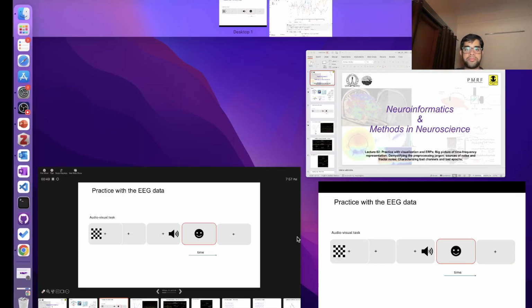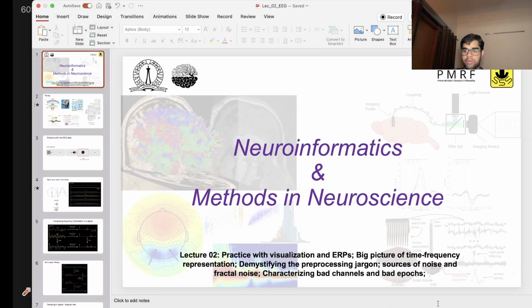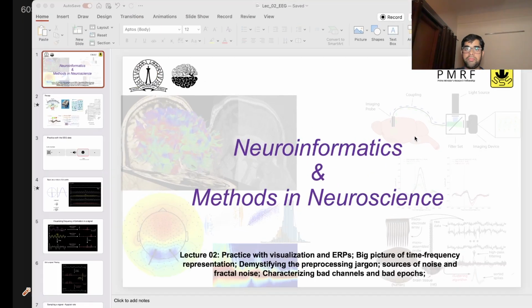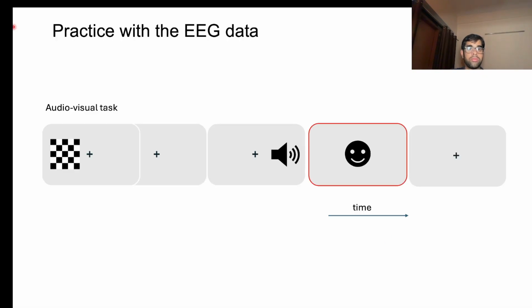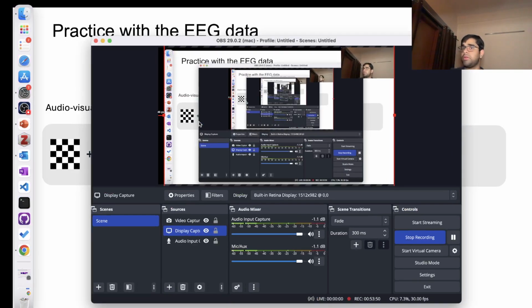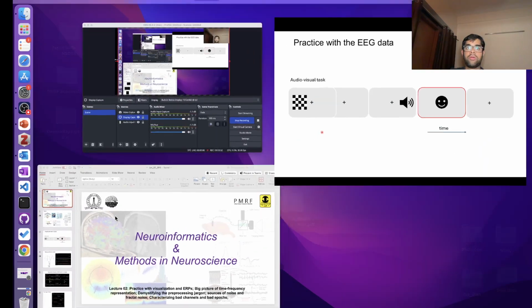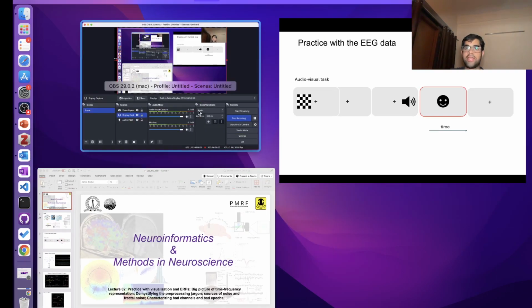Okay. Sorry. What is happening here? Okay, fine. So this is a task that we have looked into. One second. Deepak, yeah, I think one second.